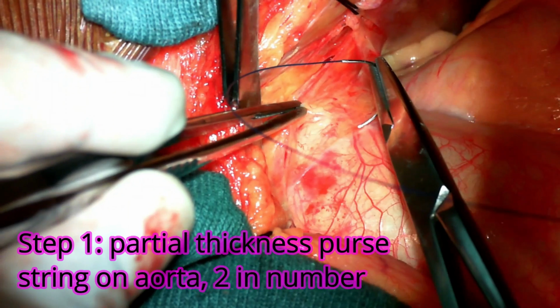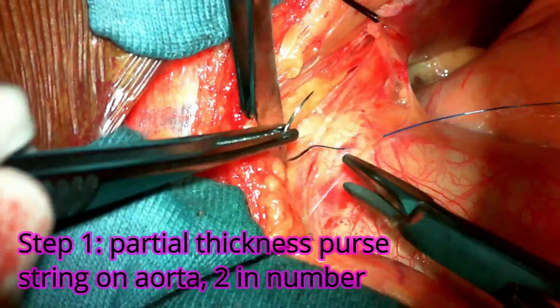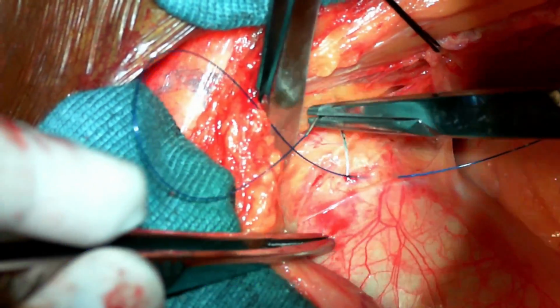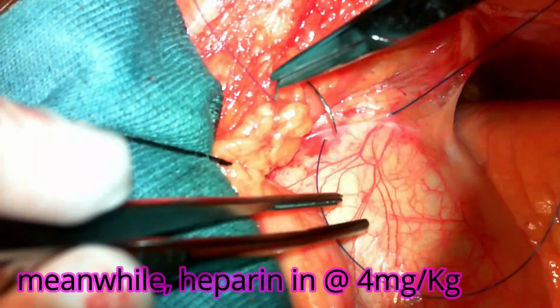Now coming to the actual steps of cannulating the ascending aorta, you have to first take the purse string on the aorta. Now as I said before, the cannula is chosen based on the body weight or body surface area.